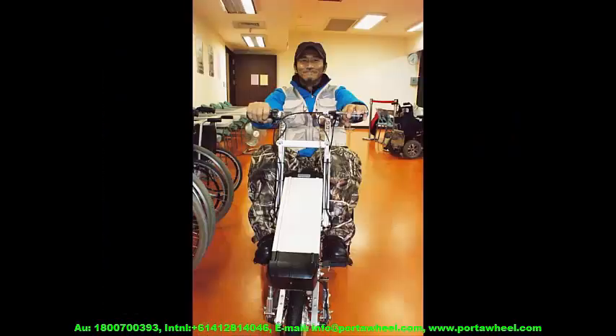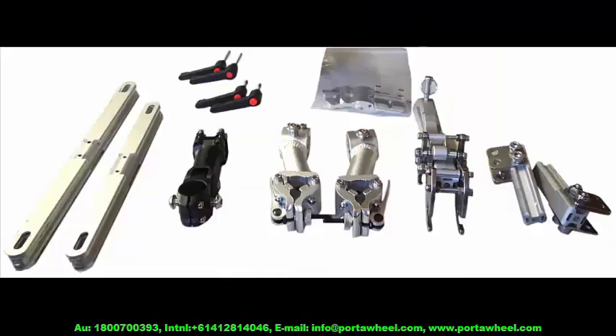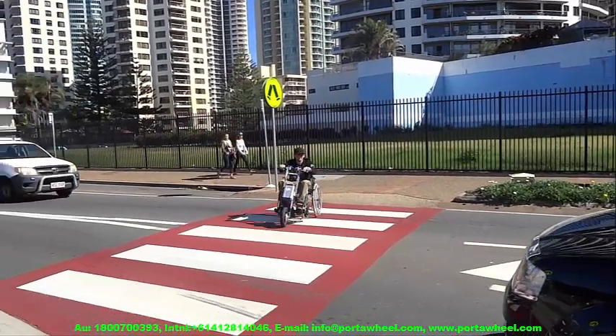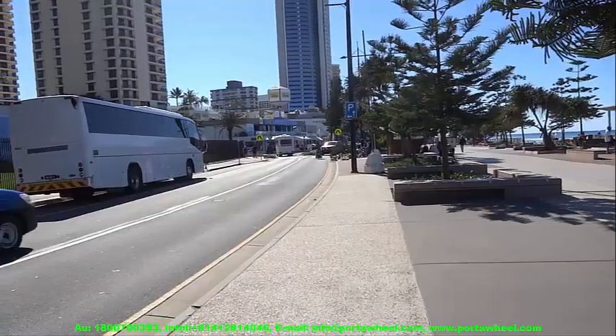Another great plus point of the PortaWheel is that it can handle any surface that your wheelchair is capable of crossing over. Depending on the wheels attached to your wheelchair, it can easily cross over rough cobblestones, thick sand, scrubby outdoor environments, and whatever other surface you feel comfortable on.